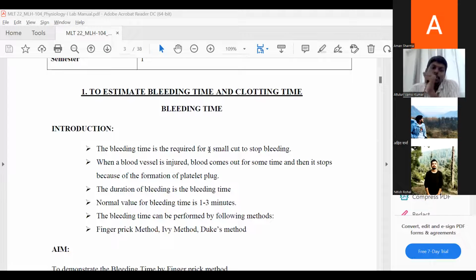Very good question. At the tip of your ear there are more blood capillaries, so we get good bleeding from the ear tip, and it is safe. Can we use the tip of the nose? We cannot. There is a chance of infection, because it is nearer to the mucous membrane, so there is a high chance of cross contaminating the surrounding tissues.